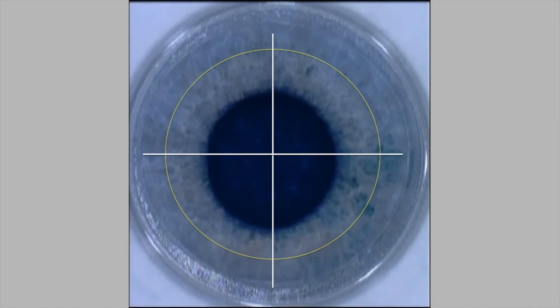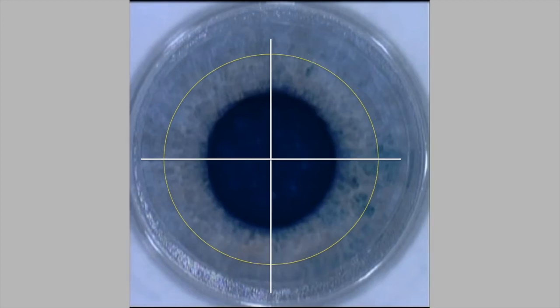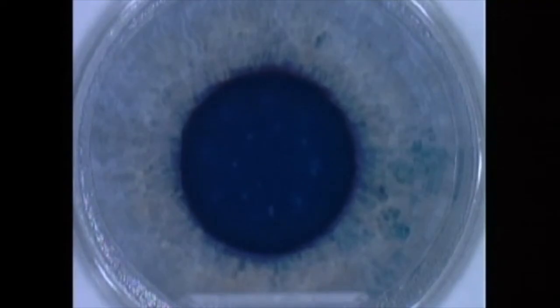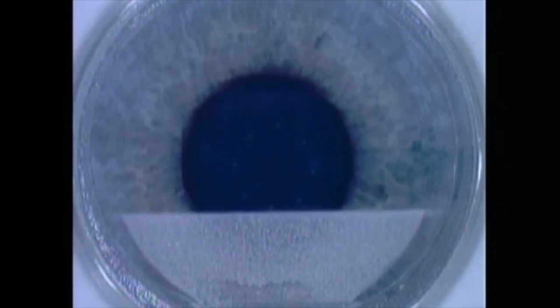Before you use the Intralase software XY controls to center over the pupil, and that helps you to get a nicely centered LASIK flap every time.